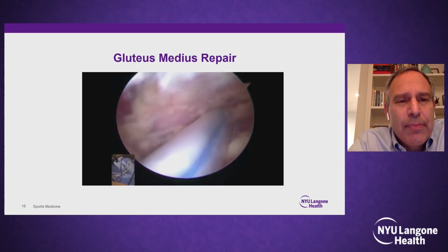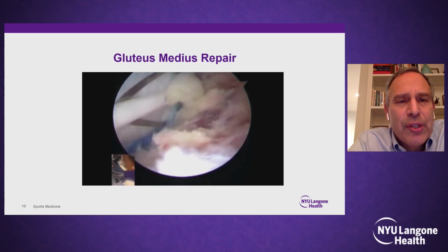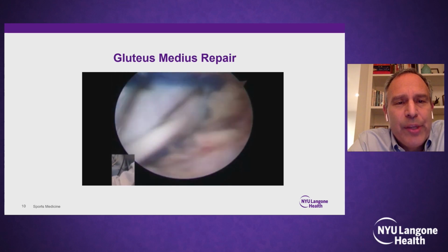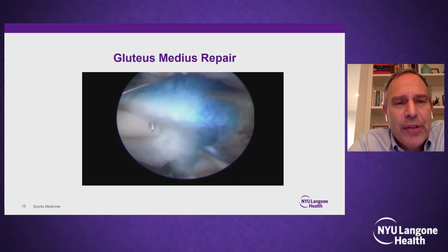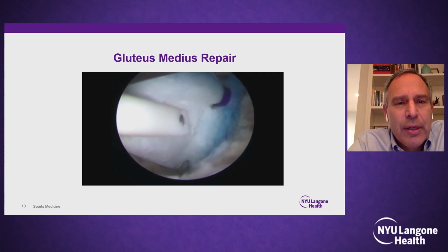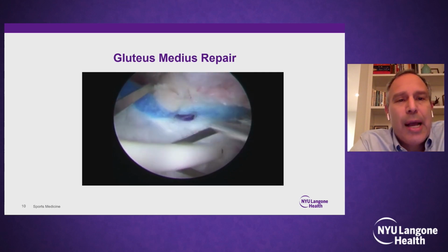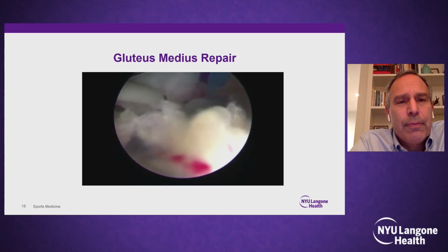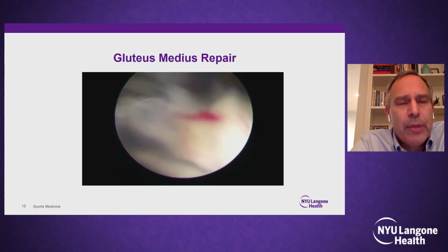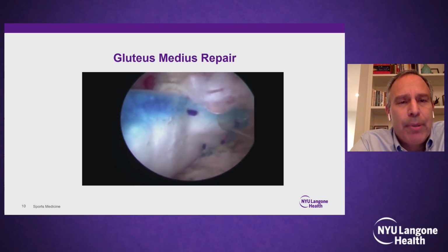I've had some interest specific to this is to add on a biologic scaffold just to thicken some of the tissue, because oftentimes there is a relatively high rate of re-tear of some of these repairs. It's just the nature of the beast of the older tissue. And the thought is if you can deliver, in this case, the Regeniten patch, arthroscopically, securing it with PLA staples and on the bone with 2 bone staples, you might add some additional tissue and bulk to the repair.